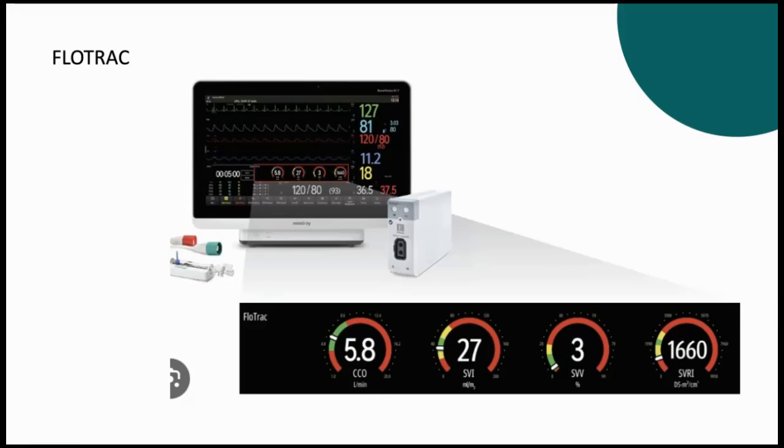We need to use it for patients where we anticipate bleeding, blood loss. You can get the cardiac output readings, the stroke volume index, the stroke volume variation, and the systemic vascular resistance index, which will guide you on vasopressors. This will guide you on your inotropes, which you use to contract the left ventricle. The more you increase your inotrope, you will see the SVI rising. The more you increase your noradrenaline, you will see the SVRI going up.